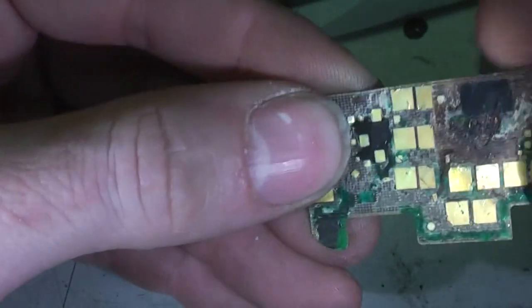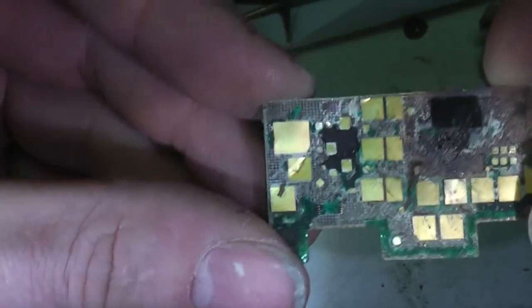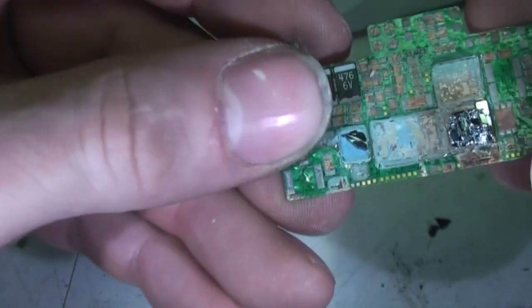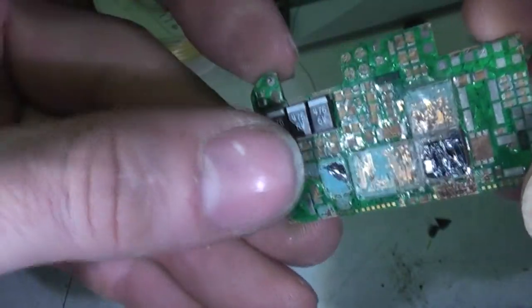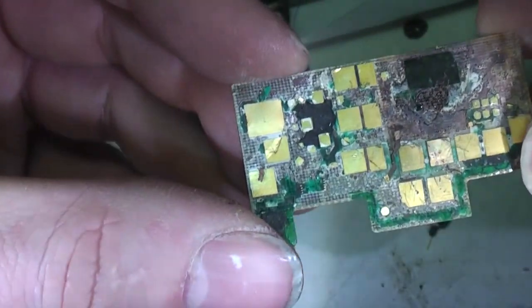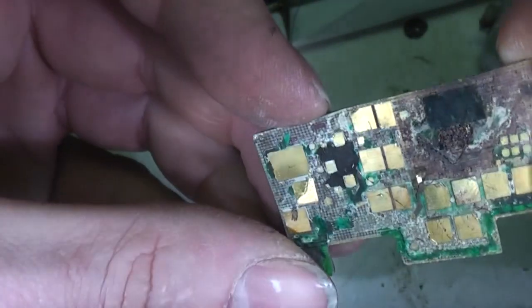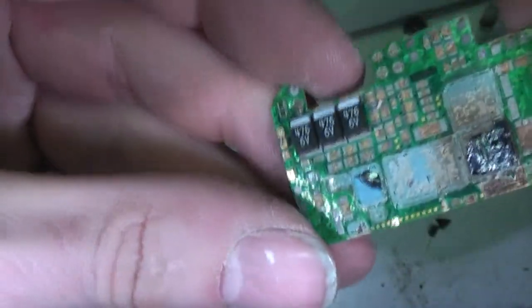And some of these chips are dated about 10 years ago, so it'd be interesting to know what the current state of the art is. Although I suppose if you're doing custom chips for this sort of thing, you want to get as much life out of them as possible. So maybe they're still manufacturing with similar sort of devices. Once you get down to a certain size, it probably doesn't really need to be that much smaller, and the size is probably dominated by the battery anyway. But interesting bit of tech.